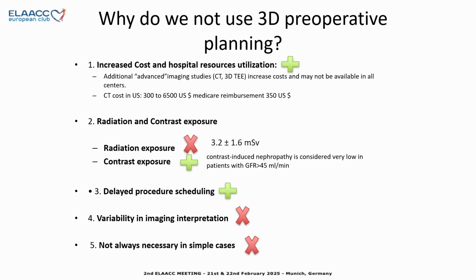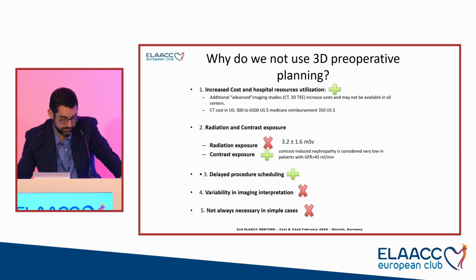I think variability in imaging interpretation is not an argument anymore, given that we have proven the superiority of the 3D modalities to evaluate the maximum and mean diameter of the landing zone and the ostium. And the argument of the simplicity of cases, I think we never know. We never know before starting the procedures.